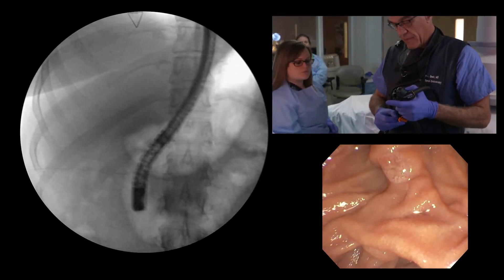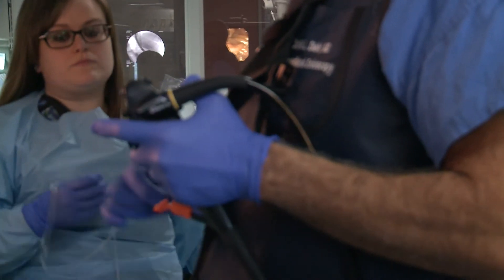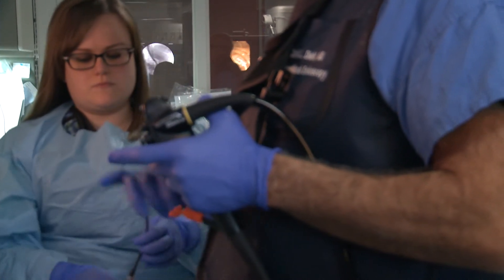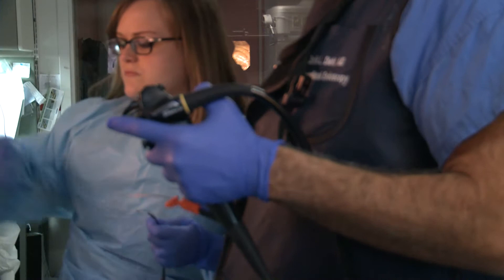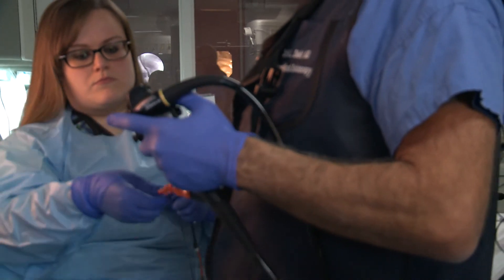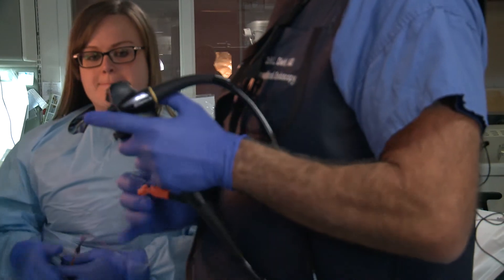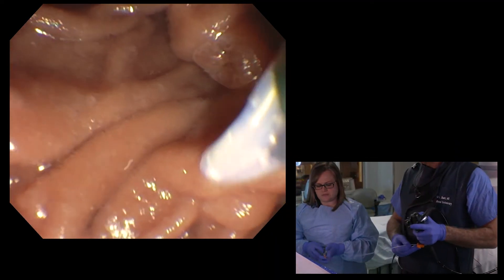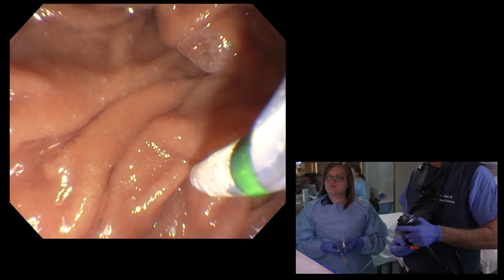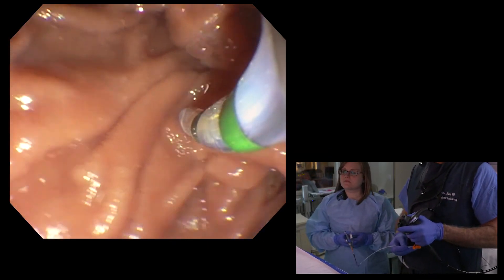Here I am with the Omnitome loaded with an Acrobat 2 wire — an 035, I believe. Nicole's going to strip the wire so I can control the wire. Some people prefer long wire, others short wire. The advantage of short wire to me is that I can control the wire, and I really like that ability to control immediately where and when the wire is advanced.